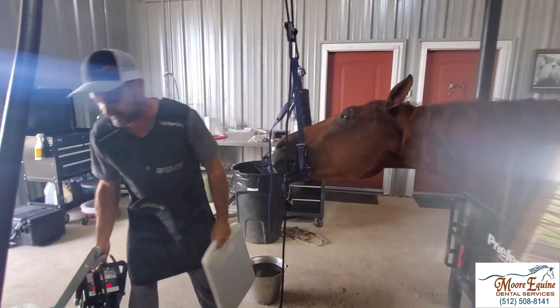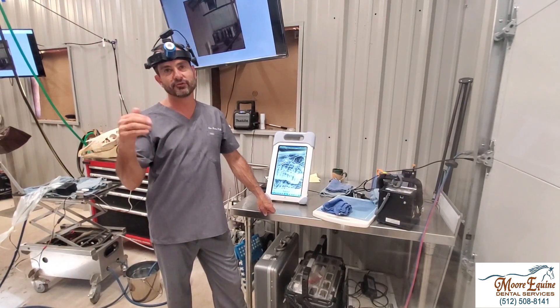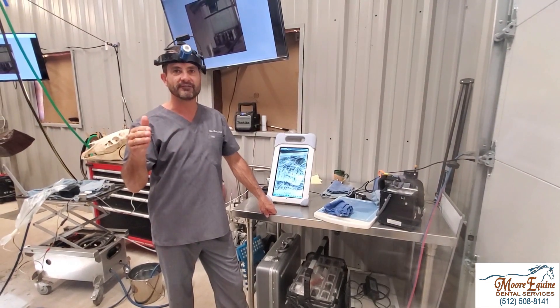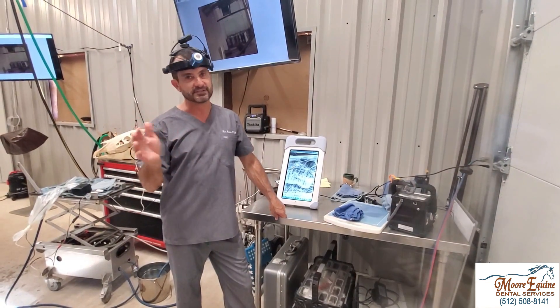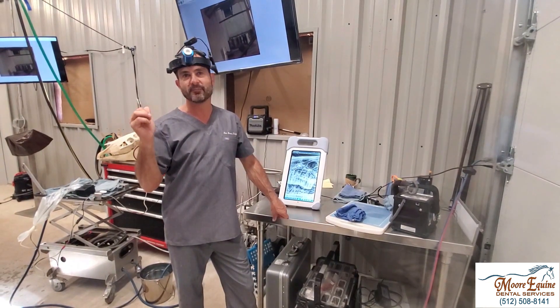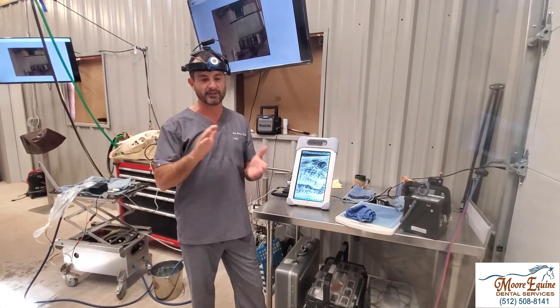Let's go take a look at the x-ray and see what it looks like. You saw how easy it is — there's really not much to it. If you're trying to shoot a palatal view or some of the DV views, which we'll show in another series, there are just a couple more views. But literally in many, many cases you're going to get a diagnostic radiograph just doing what I showed you right there.